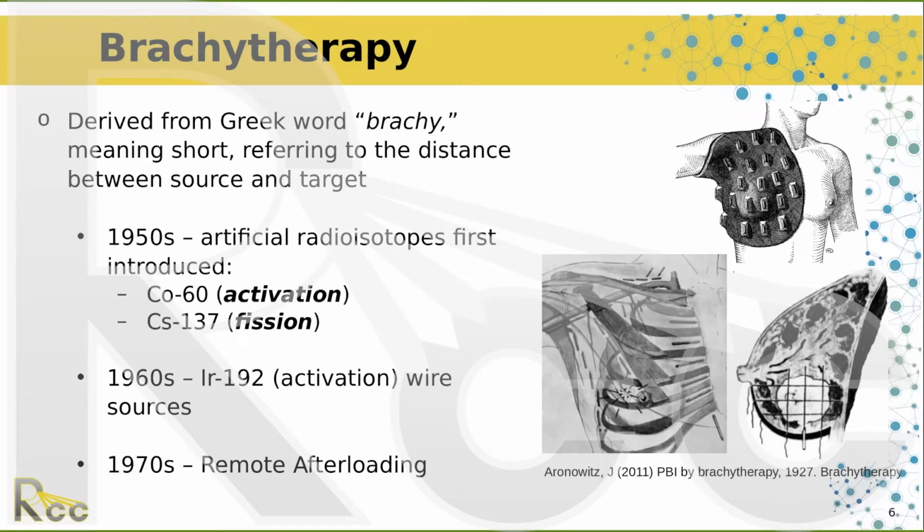For years, the needles were loaded by hand. In the 1970s, remote afterloading was introduced. In these systems, the source was on the end of a wire and the wire would be inserted remotely. This reduced the practitioner's exposure, so this is much safer for everyone.